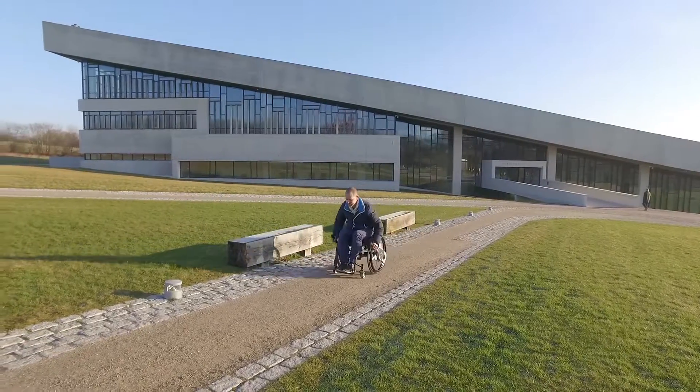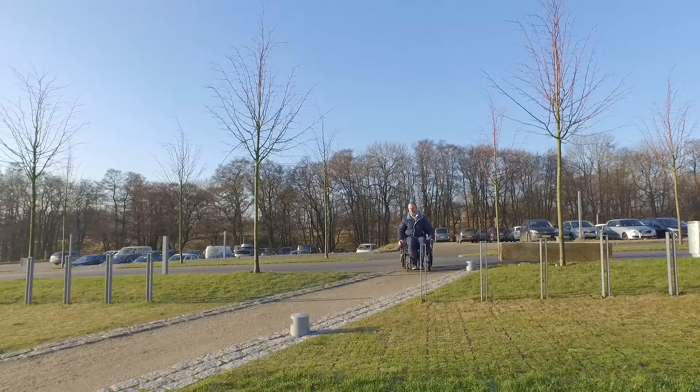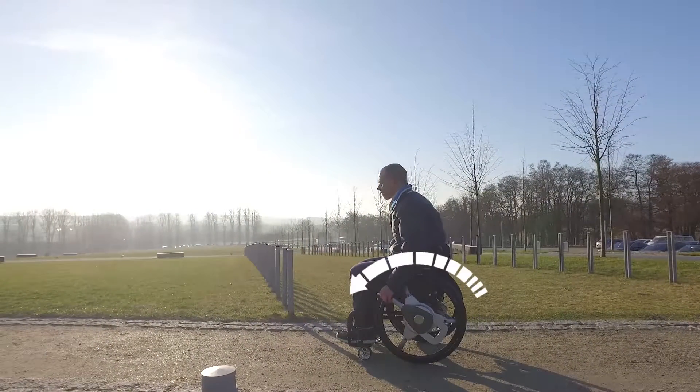A few things to know. If you find your chair starting to tip upwards as you push, this indicates that you're pushing too much at the beginning of the stroke. Instead, you want to push at the end of the stroke.